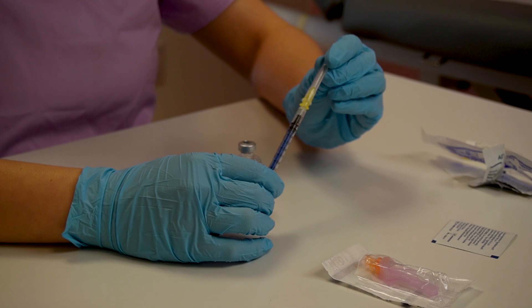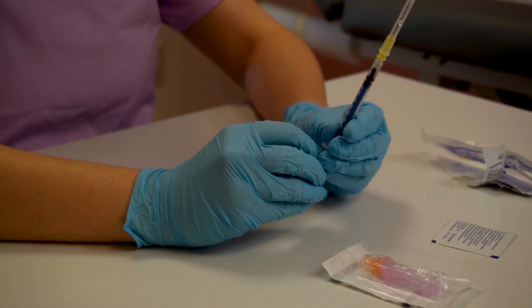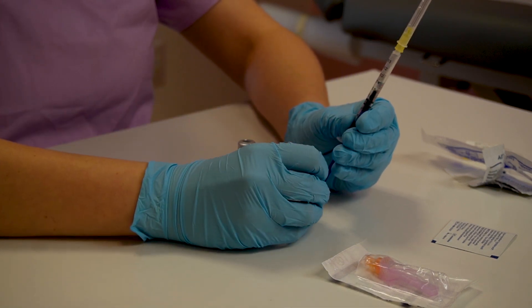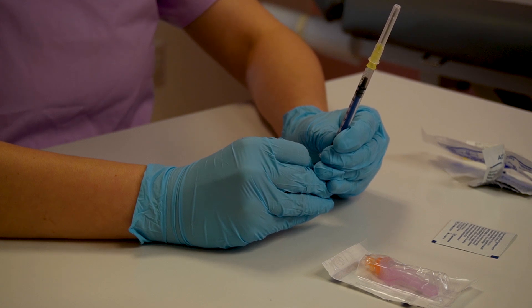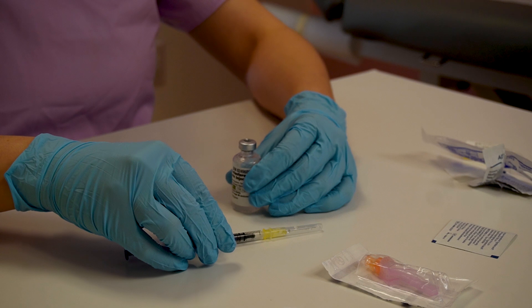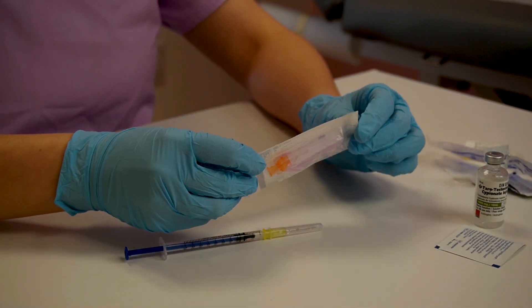Final check: make sure you don't have any bubbles. If there are any, you can always move the plunger a little bit back and forth to remove them. Now we want to change our needle — as I mentioned, a 5/8 inch, 25 gauge needle.